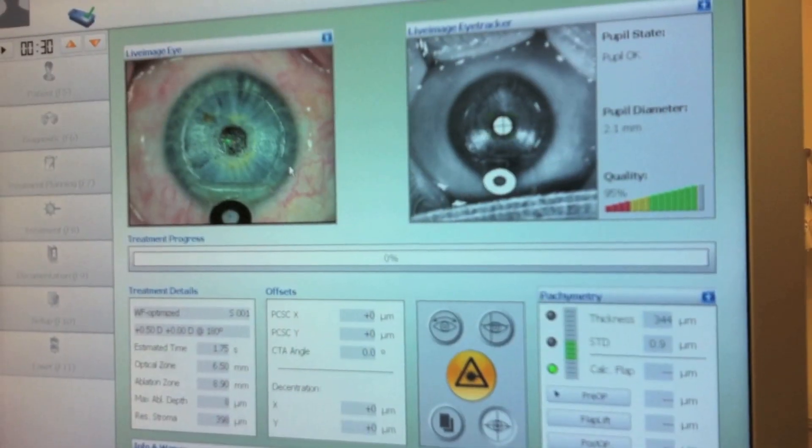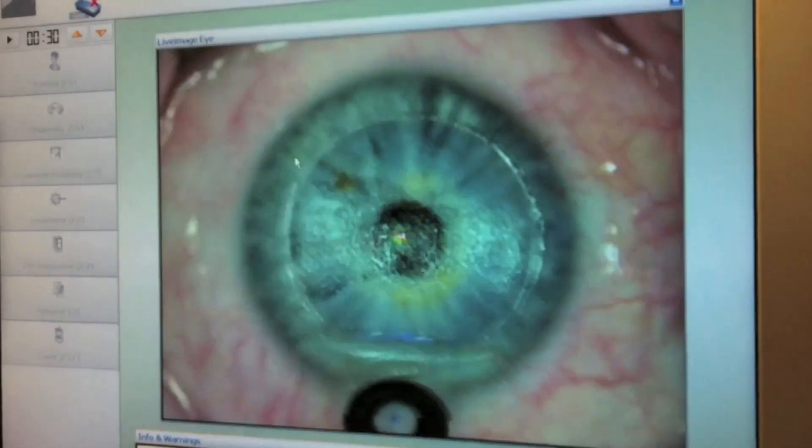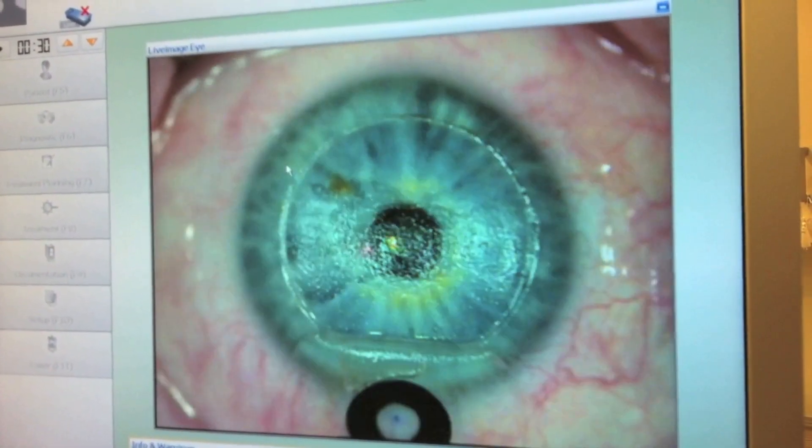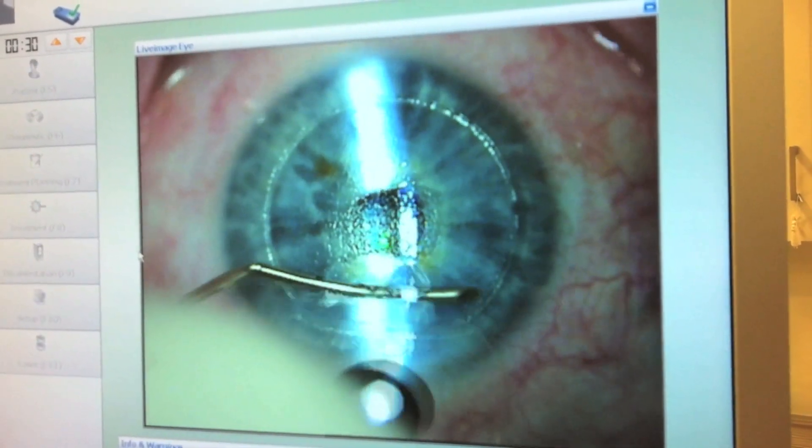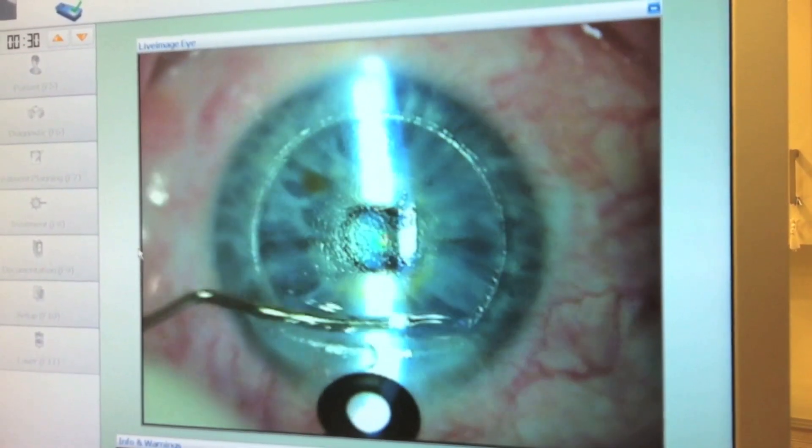It is interesting to note that the eye tracker does not track the inlay but rather the pupil, as it should. The enhancement is performed and the flap now needs to be replaced.